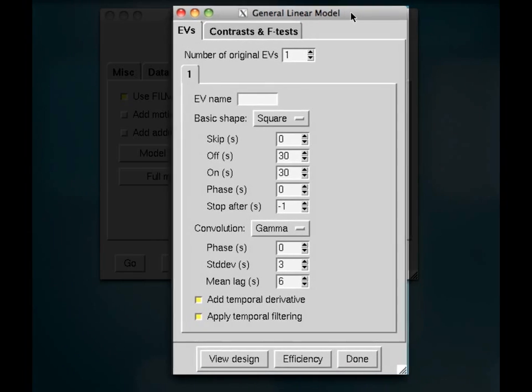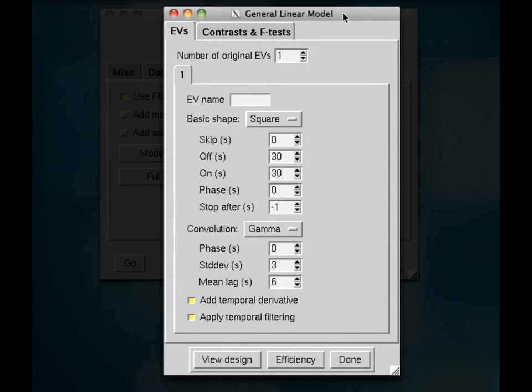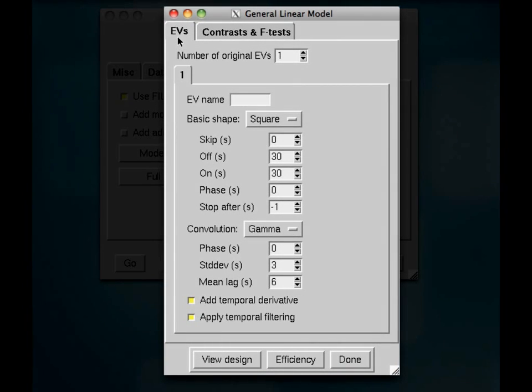And you see two tabs here, EVs, which stand for explanatory variables. Just think of those as regressors. And then the contrasts and F-tests that we can set up after we've specified our EVs.